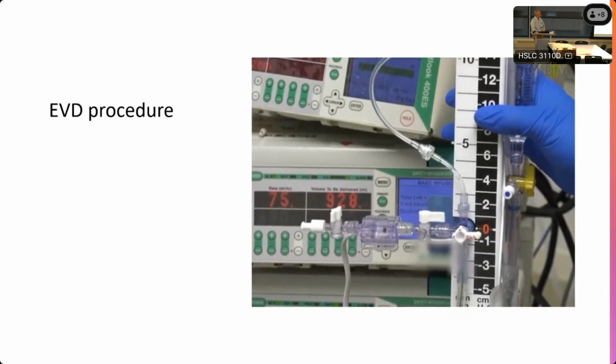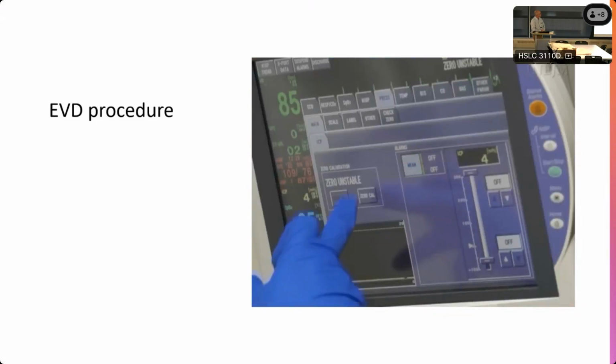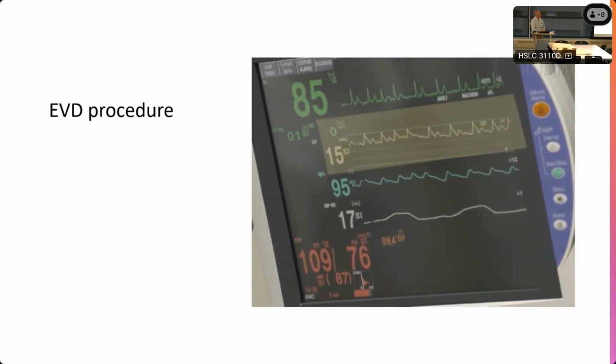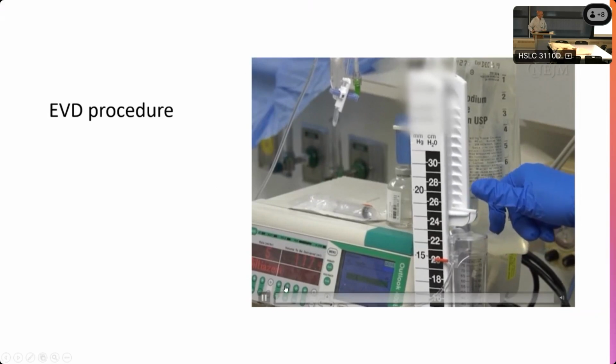Adjust the height of the collecting system so that the pressure transducer is level with the external auditory canal, and then set the transducer to 0. Wait a few seconds for the triphasic intracranial pressure waveform to stabilize, and then record the first consistent reading. This will be the opening intracranial pressure. Set the height of the collecting system to the desired level, which depends on the intracranial pressure.